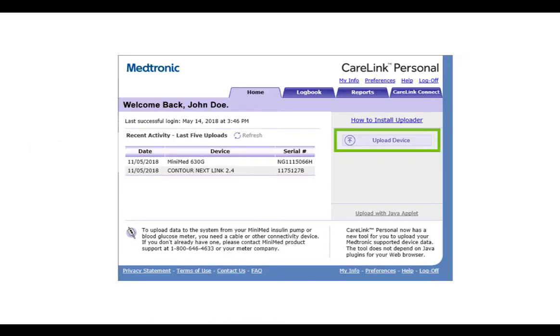Next, enter your username and password to sign into CareLink personal website and click on upload device. The uploader will start.